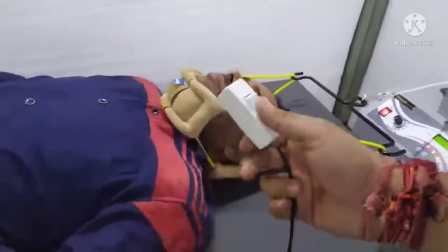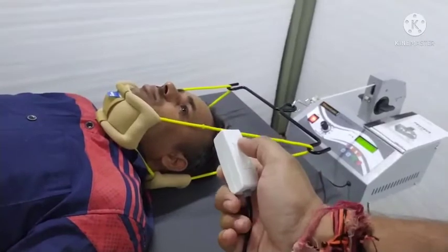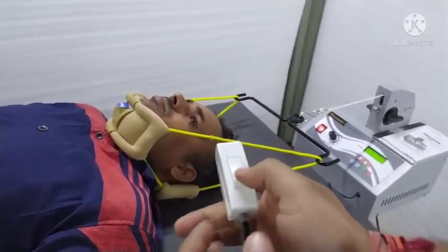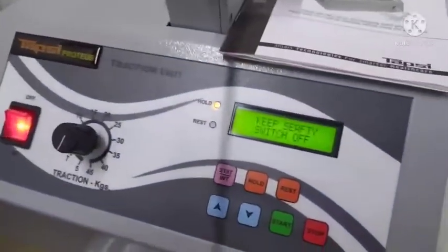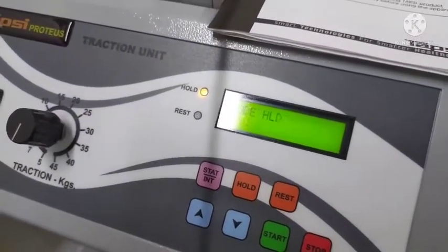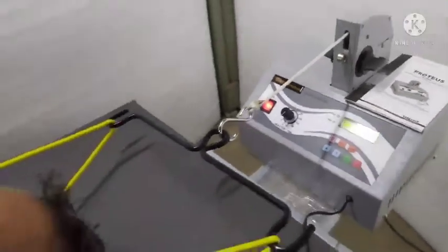In any case of emergency, the patient can use this emergency key so he can stop the treatment. If the patient presses the key, the machine is beeping. Okay, and treatment is stopped.